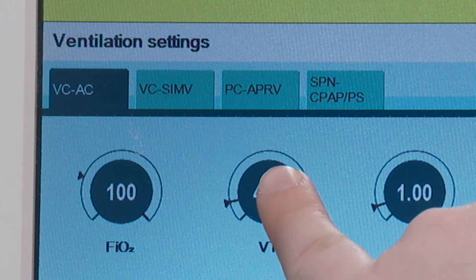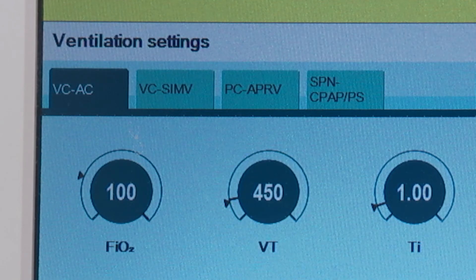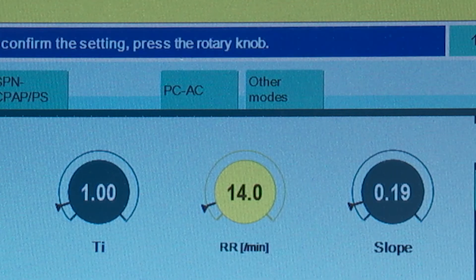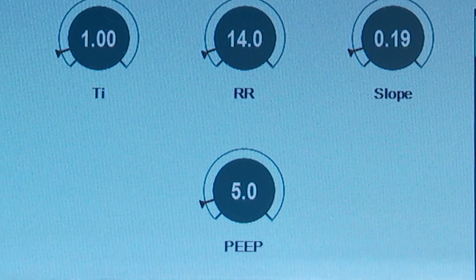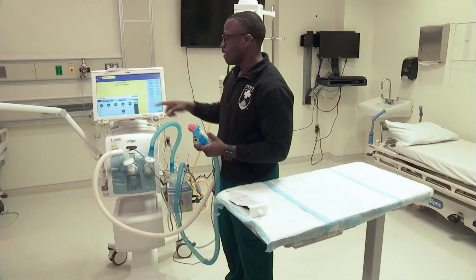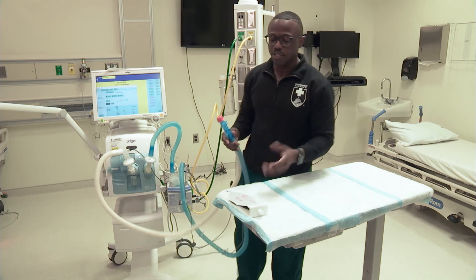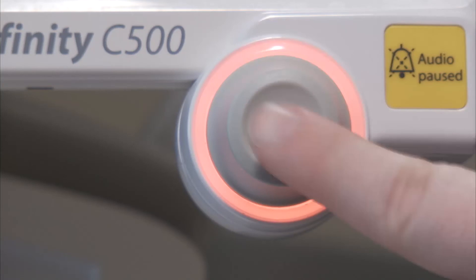We can input our tidal volume based off of what we want to do to maintain acid-base balance. We can also adjust our respiratory rate — I'll just twist it to 14 and then confirm. You can also titrate your PEEP there as well, and then hit confirm. I'm going to press X, and now at this point we're ready to ventilate our patient. This test lung is going to be my patient today. Hit start ventilation on the screen and confirm.